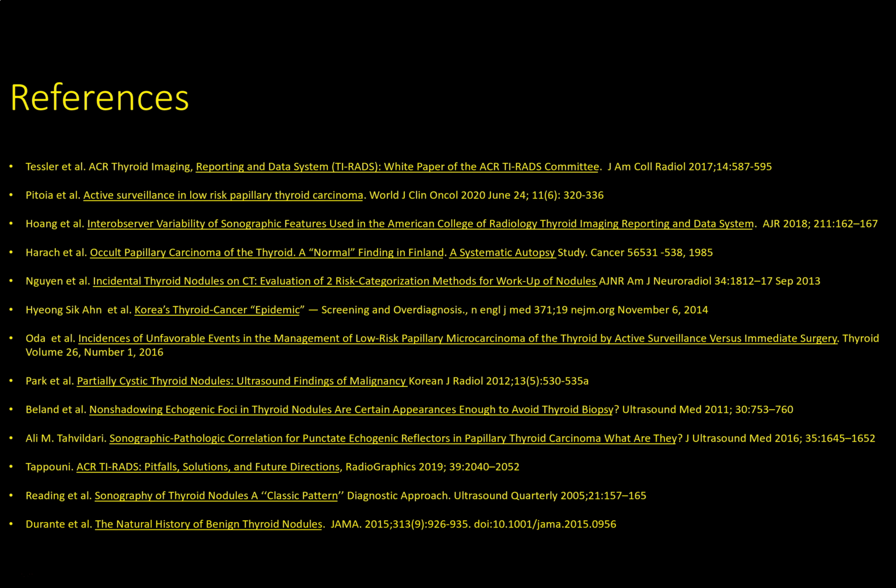This concludes the intro part, covering all the TIRADS characteristics. These are some of my references. Now we're going to proceed with going through some of the nodules on a case-by-case basis.